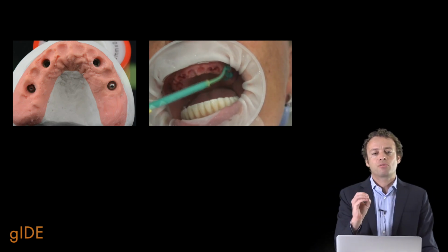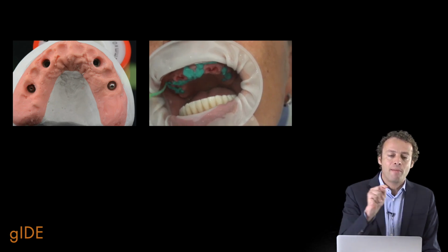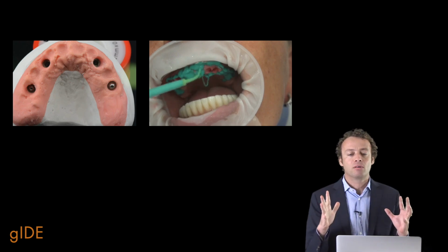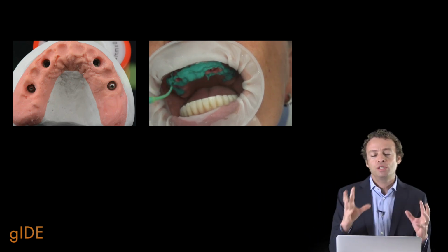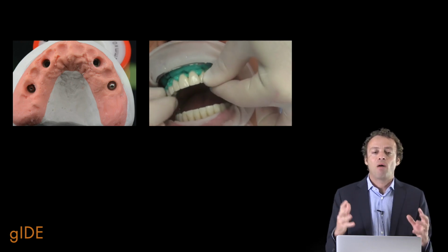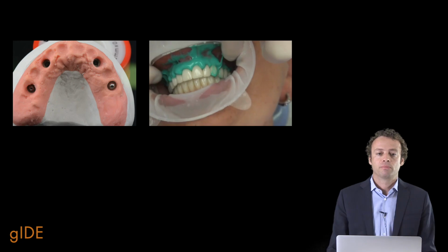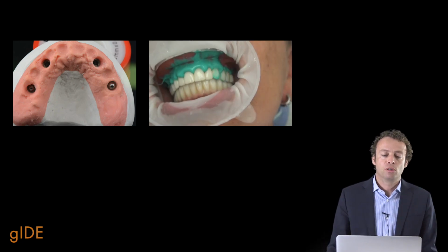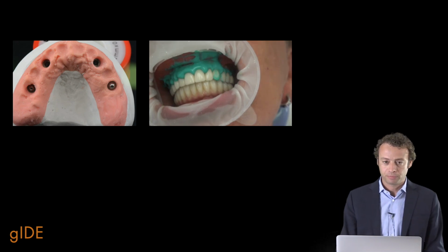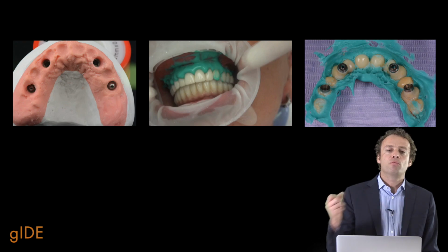to use the temporary restoration to copy the soft tissue morphology in the mouth when the temporary is correctly screwed in the mouth. In that way, my silicone is able to copy the soft tissue morphology exactly the same way that we have in the mouth when the temporary restoration is correctly screwed. So we check the position with the occlusion, and then of course we screw the temporary restoration intraorally. And this is what you achieve after the complete setting and when we remove it.